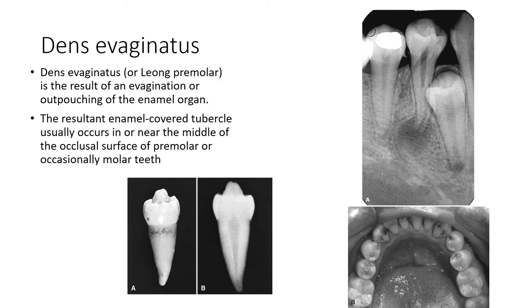Dens evaginatus, also called Leong's premolar, occurs as a result of evagination or outpouching — literally the opposite of dens in dente. Outpouching of the enamel organ results in an enamel-covered tubercle that usually occurs in or near the middle of the occlusal surface of a premolar or occasionally a molar. Many times this protruding tubercle gets worn down, resulting in the tooth becoming infected. You can see in image A that there is already periapical pathology in the tooth.